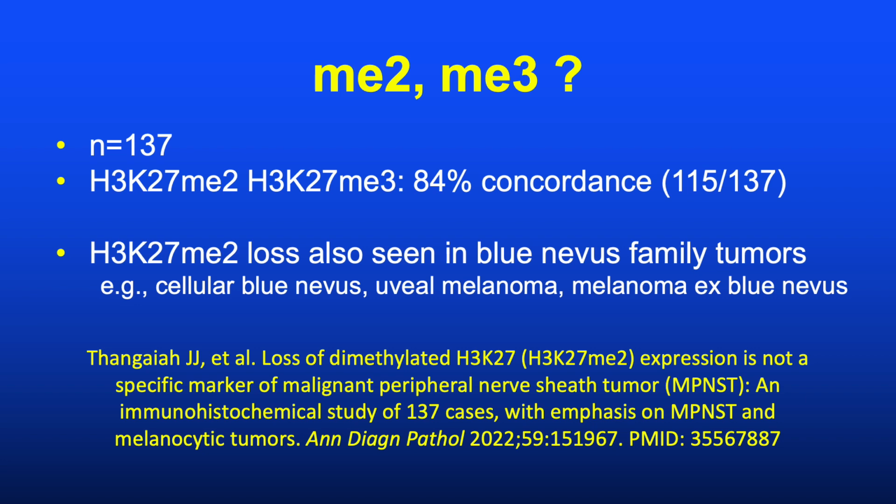Subsequently, the study cited here looked at both in comparison with a wide variety of tumors, both melanocytic and neural tumors and beyond, and found that there does seem to be limited diagnostic specificity for both of these markers. And I think that, speaking for our own lab at least, most laboratories do not have these markers at the ready. So I think in practice, with these tumors being rare enough, I'm still going to be focusing and relying on the clinical setting and hopefully that characteristic loss of the strong S100 or SOX10 staining that I would expect in melanocytic tumors, but is more characteristic in MPNST, with the exception of the epithelioid variant of MPNST.